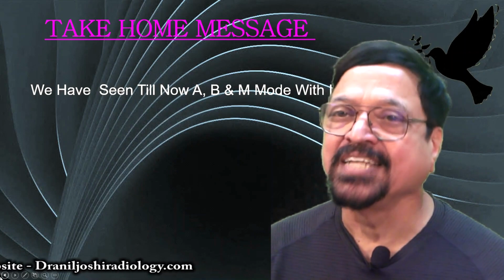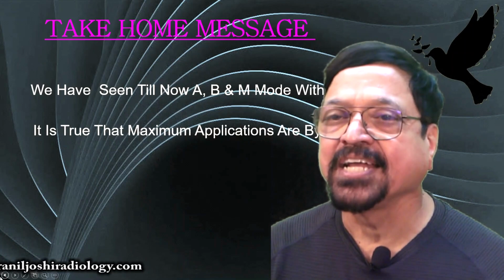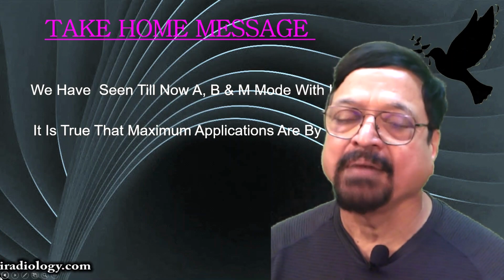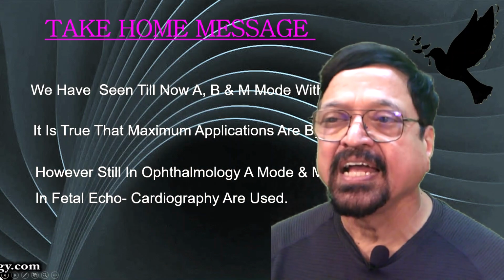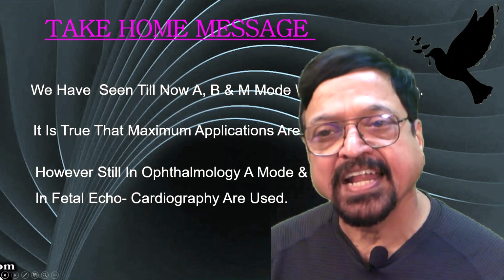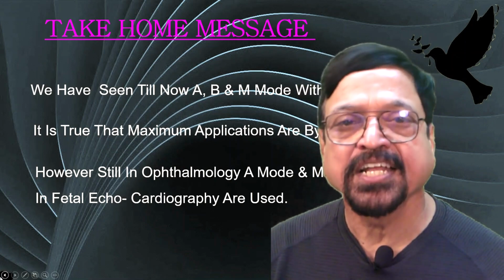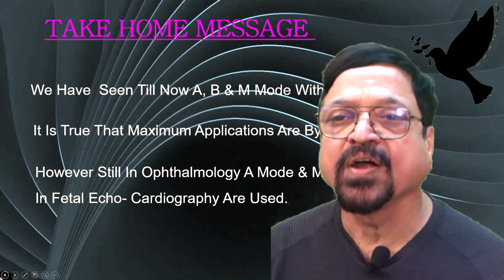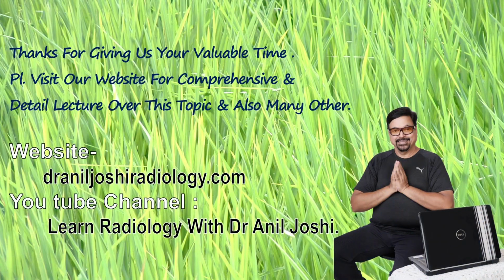Now a take home message. We have seen till now A, B and M mode with their applications. It is true that maximum applications are by B mode. However, still in ophthalmology A mode, and M mode in fetal echocardiography, are used. So they are important in obstetric sonography to know the fetal heart, as well as in echocardiography either of the fetus or of the adults.